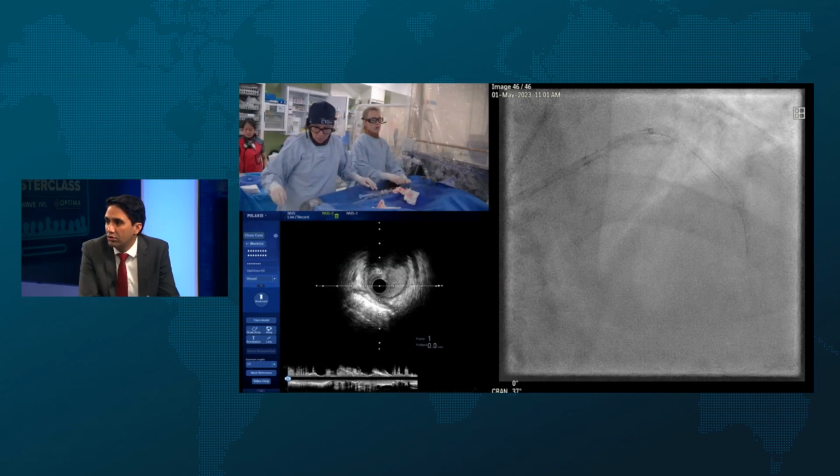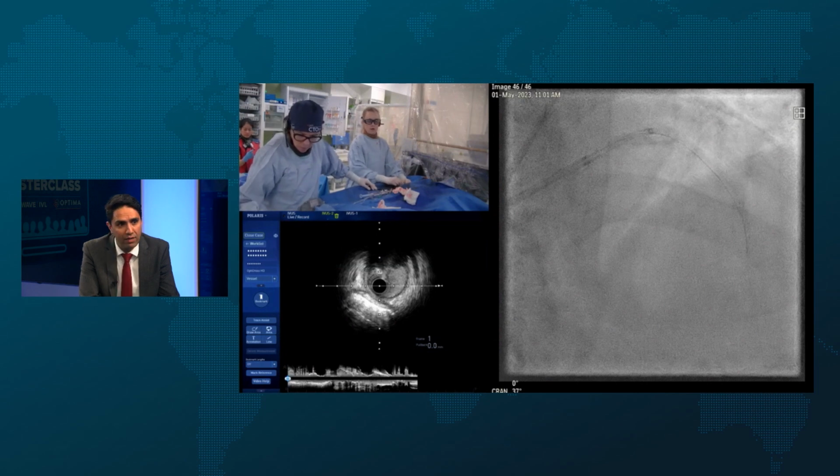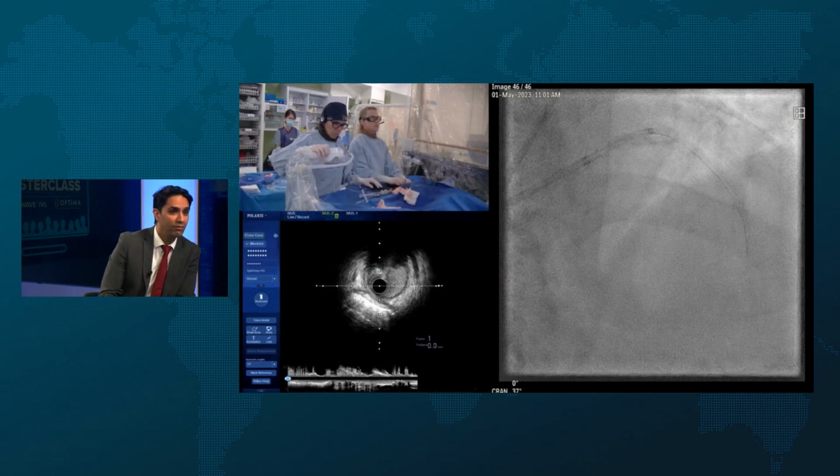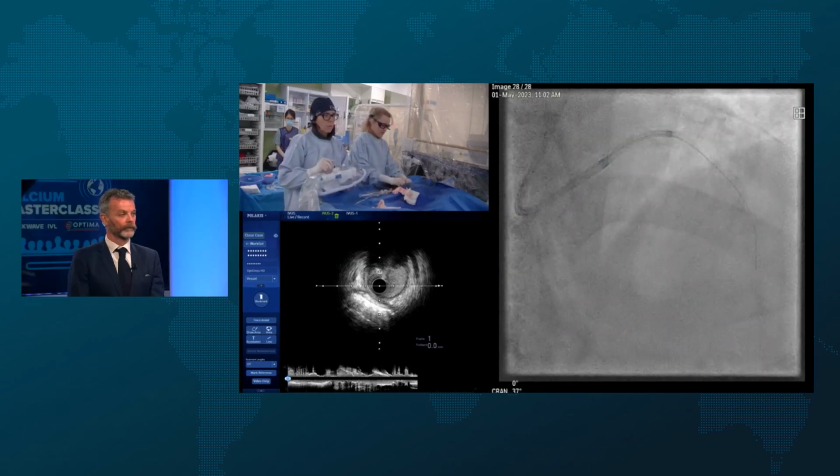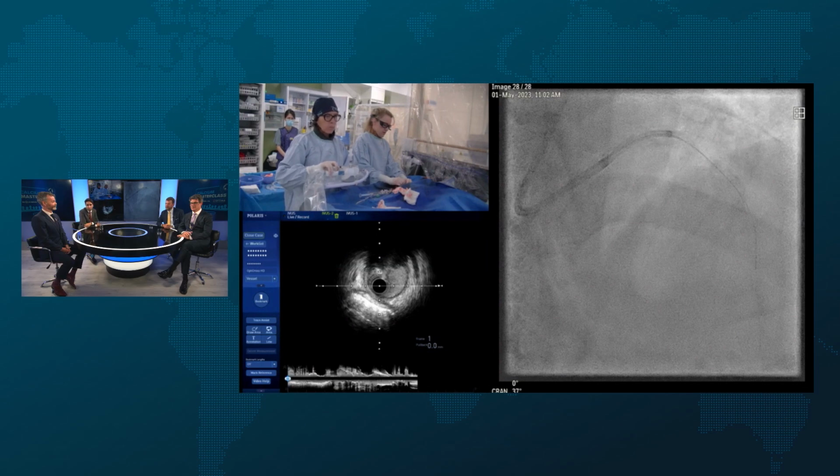I think you could probably stent here and then use a post balloon to size by MLD max of this, or IVUS. Yeah, but to your point, then you have a scaffold in the way, and with a much bigger artery, I often will use that 1-to-1 NC, especially when my Shockwave was a bit undersized.